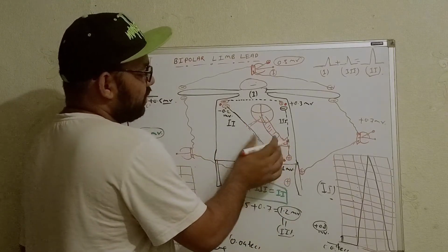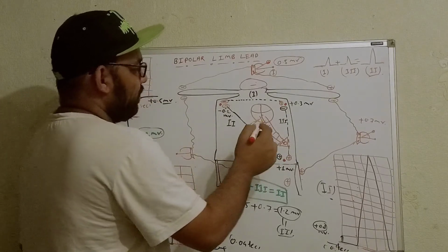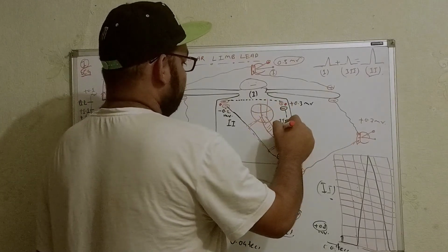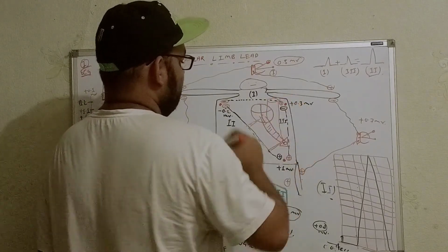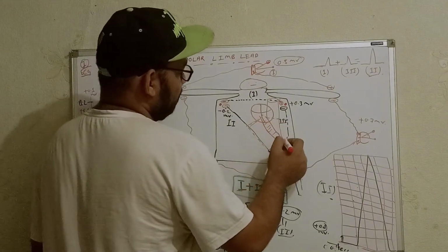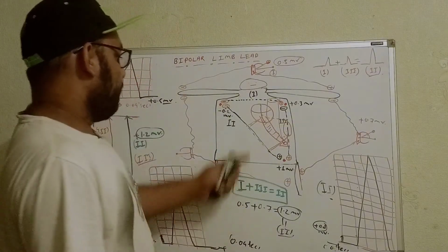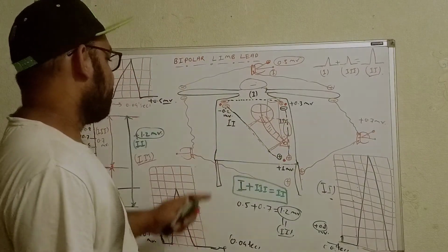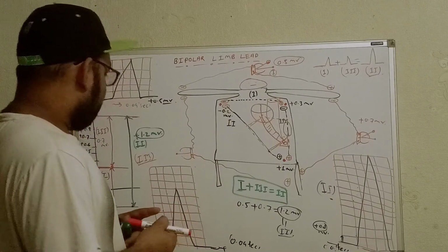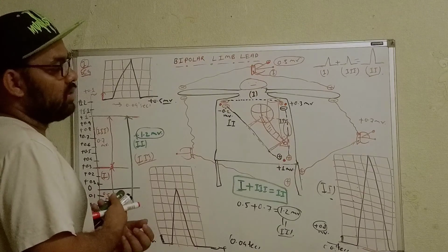As a result, we will see the potential difference will be much greater in terms of lead number 2. But if you compare with lead number 1, very little part will come in this way, and in terms of lead number 3, we will get only little portions in this way, that will be parallel to the major perpendicular depolarization vector, but in terms of lead number 2 we will get the maximum part. Okay, so that was all about the different aspects in terms of the voltage difference.